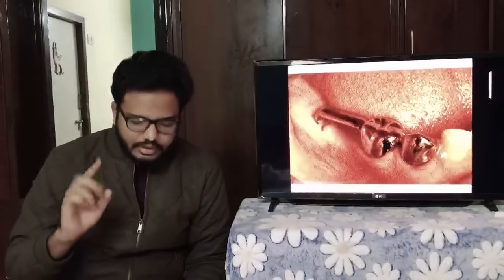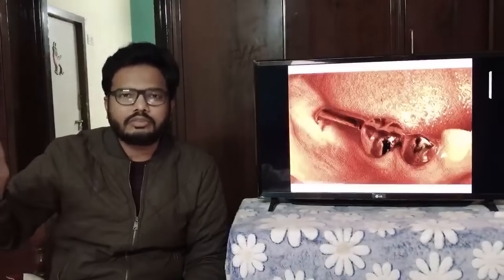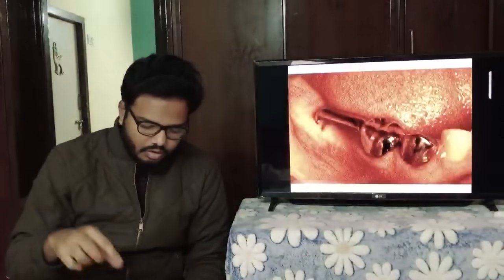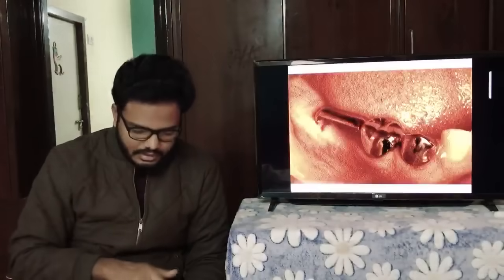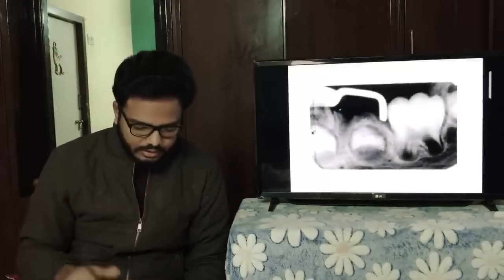So you can see, if at all there is loss of primary second molar, usually primary second molar helps in maintaining or guiding the eruption of permanent first molar. So if at all primary second molar is lost, then we create this crown or band-like structure on primary first molar with a distal extension, which is in fact an intra-alveolar appliance. So you can see radiographically the metal going deeper, 1.5 to 2 mm, gingival to mesial marginal ridge of first molar, in order to guide the eruption of permanent first molar, in order to prevent mesial tipping or mesial migration of teeth, as you know. So the appliance here is distal shoe or intra-alveolar appliance.